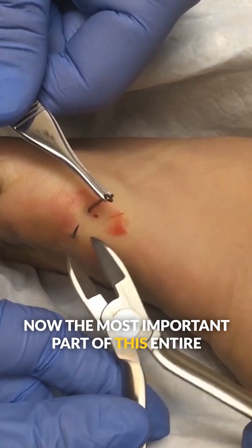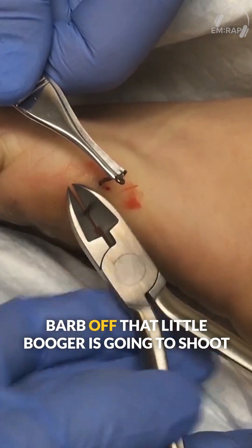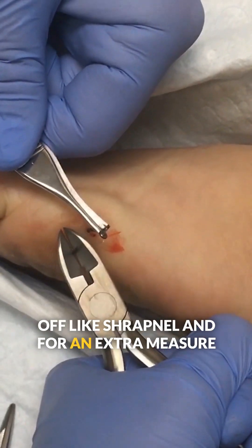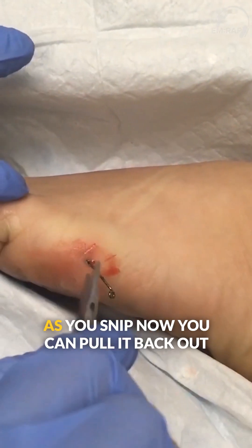Now the most important part of this entire procedure is that everyone in the room wears eye protection, because as you cut this barb off, that little bugger is going to shoot off like shrapnel. And for an extra measure of safety, just go ahead and put a piece of gauze or a clear eye shield over the wire cutters as you snip.